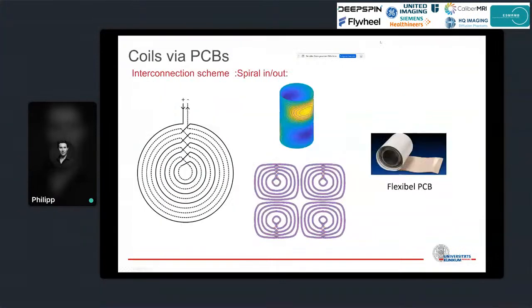And also, if you specify it, you can get some kind of PCB layout. We used that for one project, for example this transverse gradient, where you optimize the gradient and then use the outputted 3D vector graphic. In this approach, the interconnection is a little bit different.